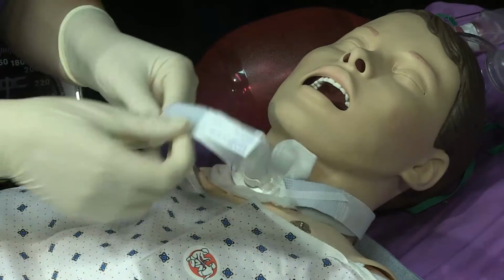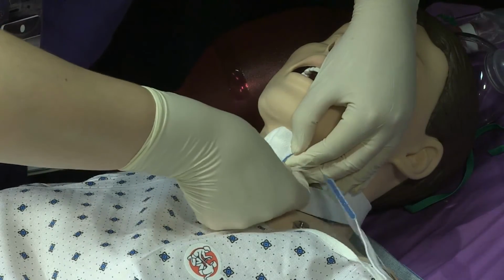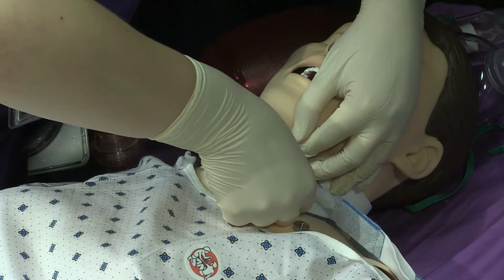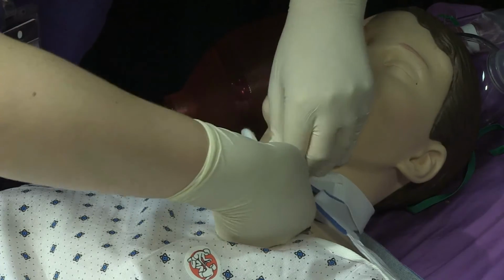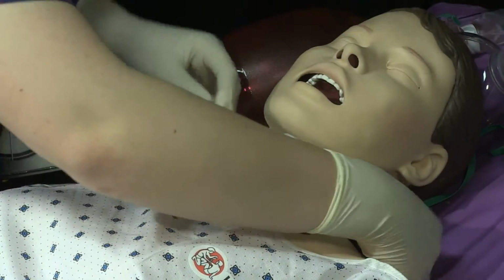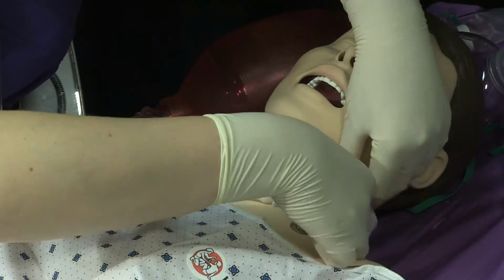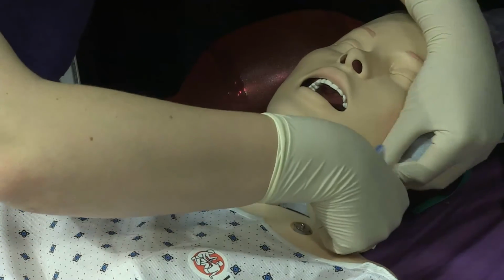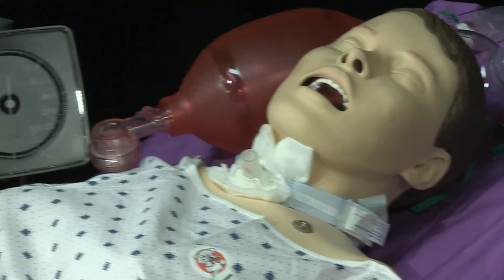Secure new holder before removing old holder. Remove and dispose of gloves and perform hand hygiene.